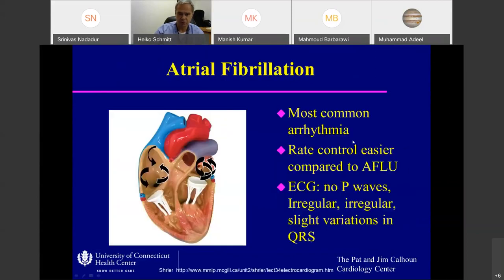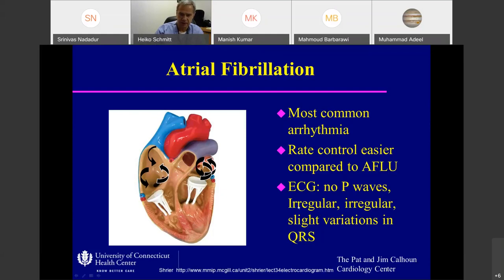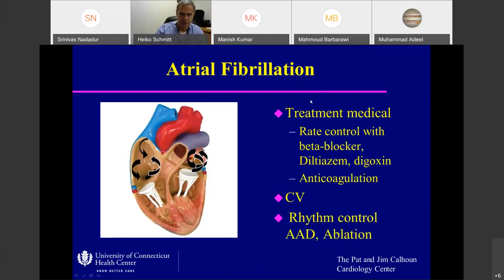Atrial fibrillation is the most common arrhythmia, caused by multiple wavelets in the right as well as left atria. It is relatively easy to rate control. On ECG, you have no P waves and it is irregularly irregular — there is no pattern to the irregularity. Compare this to flutter, where there is often a pattern, or Wenckebach, which always has a pattern. Typically you also see slight variation in the QRS complex because of the irregularity — your filling changes and the axis shifts a little bit from beat to beat.